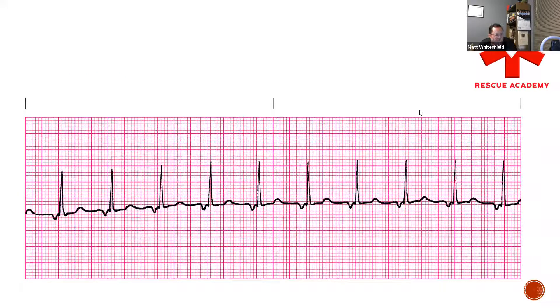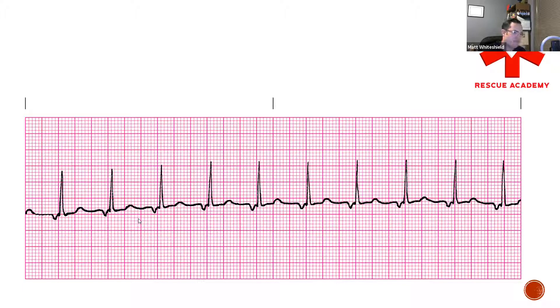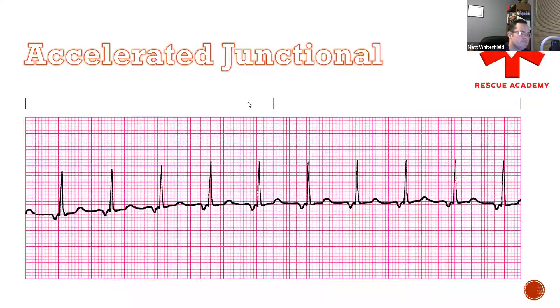What happened to the P-waves here? We have inverted P's. We still have atrial contractions occurring but they're flipped upside down, and they're before the QRS complexes. Our QRS complexes are still narrow. We have a rate of about 100 — maybe just over 100, but not quite close enough — it's accelerated junctional.